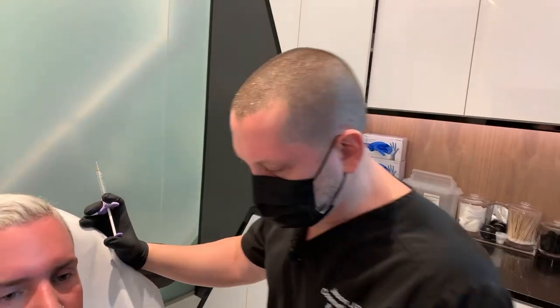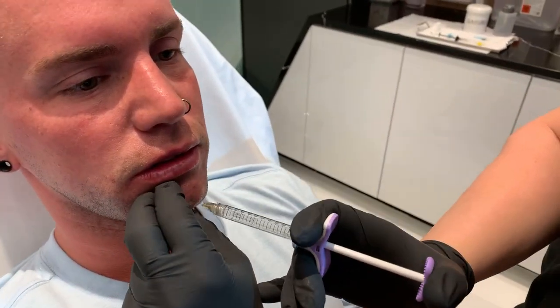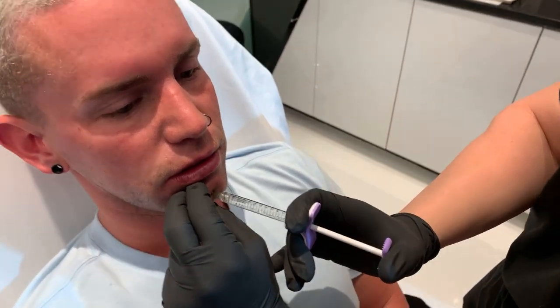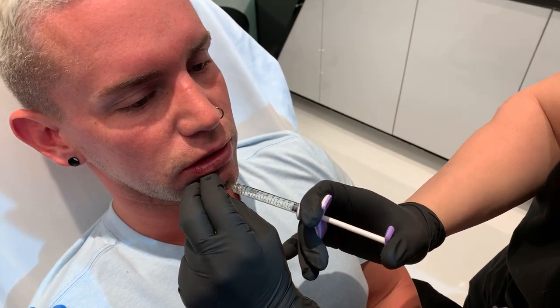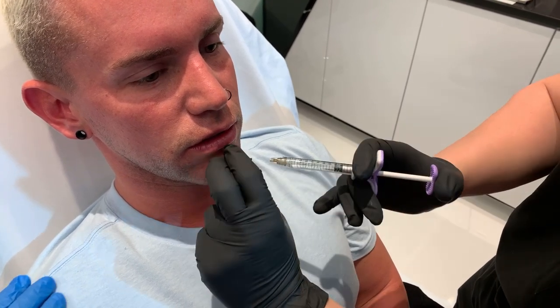We really want the lip to kind of balance and come forward while also projecting the chin. The chin gives support to the lip, especially the lower lip. And this area right here, called the lower cutaneous lip, supports the corners of the mouth and the lip. So we're gonna work on the chin and we're gonna work on the lip. We're gonna start today with a product that gives me a little bit more substance in this area on the chin called Juvéderm Ultra Plus. This will hold a little more volume here and project, but the idea is some sort of width and balancing.